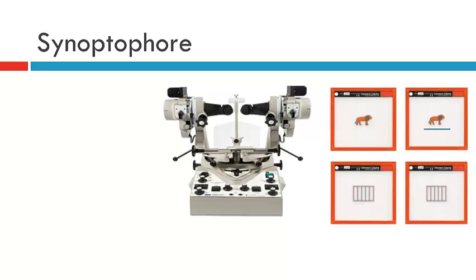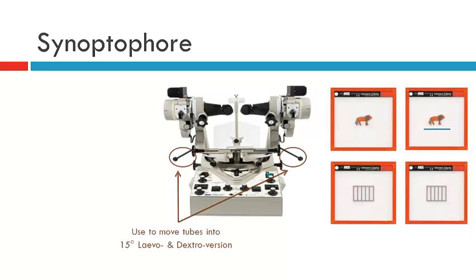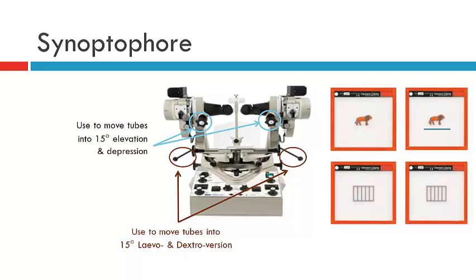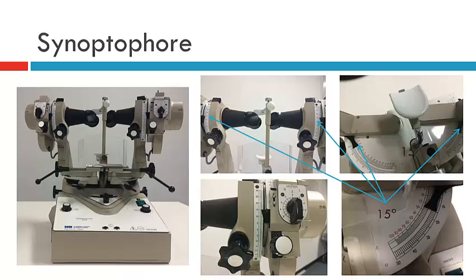Moving on to the synoptophore controls — we have the horizontal levers which move the tubes horizontally. Moving both tubes to the right puts the patient into right gaze; moving both to the left puts them into left gaze. We can also move the tubes up or down using separate levers, and generally we'll move these 15 degrees up or 15 degrees down.